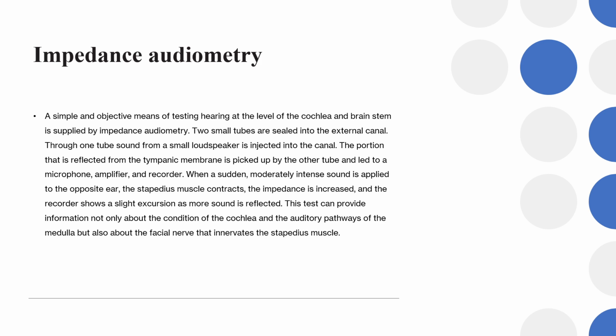Impedance audiometer, a simple and objective means of testing hearing at the level of the cochlea and brainstem. Two small tubes are sealed into the external canal.